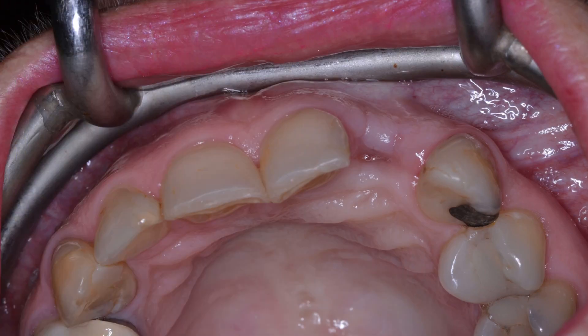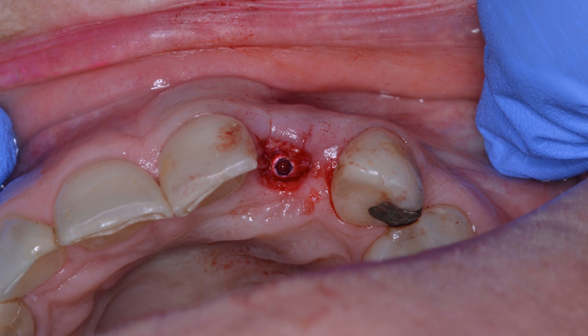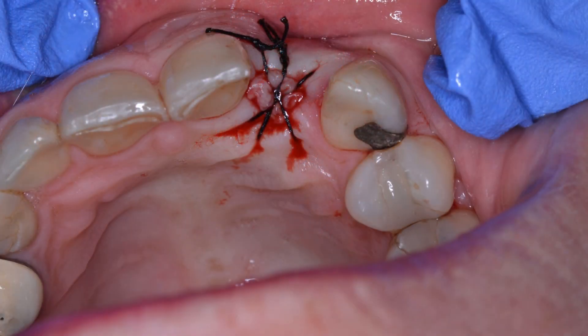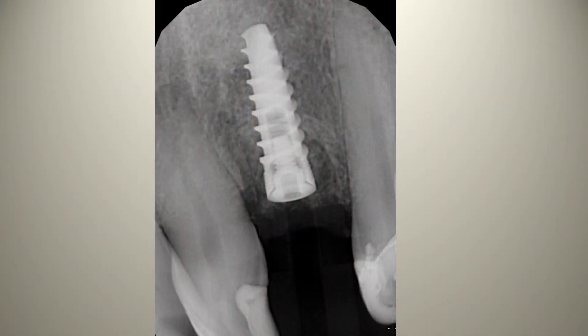We retract the tissue and you can see where the tooth is missing and where the implant has been placed using the sticky bone protocol. Notice we kept the buccal tissues intact — we didn't reduce blood flow to the periosteum by lifting it up, nor to the interproximal bone. A trick I learned from a periodontist colleague. In this way, you have the most predictable long-term solution for maintaining interproximal papillae. We get some platelet-rich fibrin membrane — not the injectable version — and suture that on top.